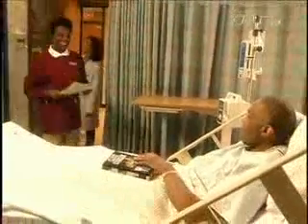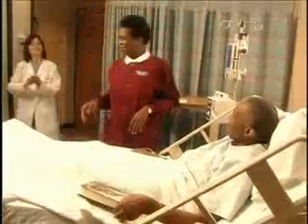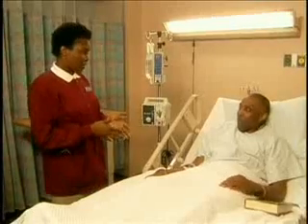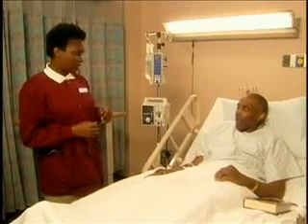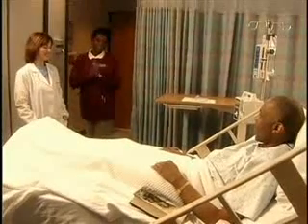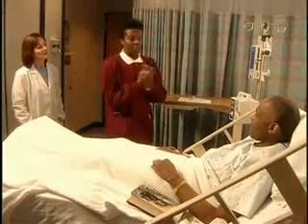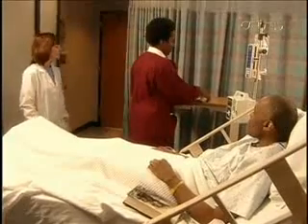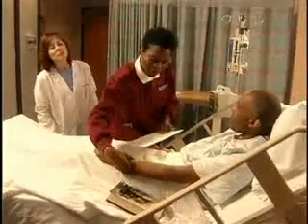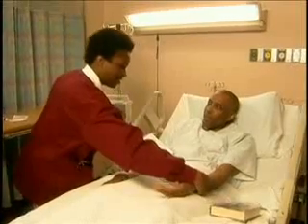Good morning, Mr. Nixon. How are you? This is Ms. Swenson, my instructor. She'll be observing, okay? Pleasure. Now, I have an antibiotic for you. Would you mind if I administer it now? No time like the present, I say. Okay. I'd like to check your ID band and compare it to the MAR chart. What's your name, please? My name is Robert Nixon.